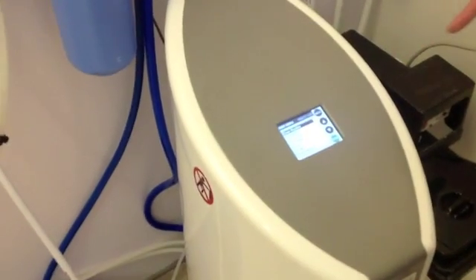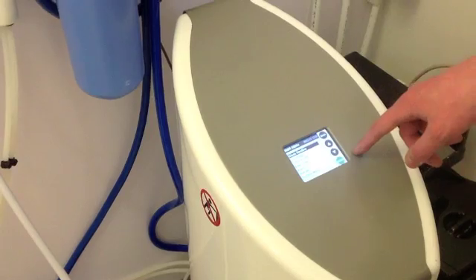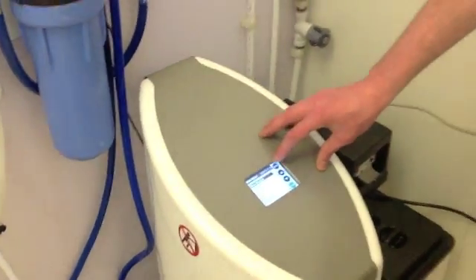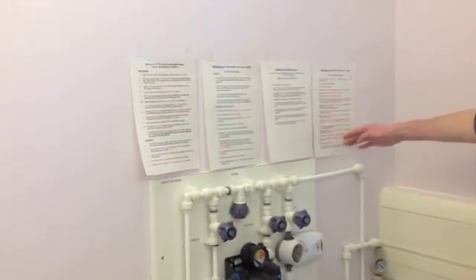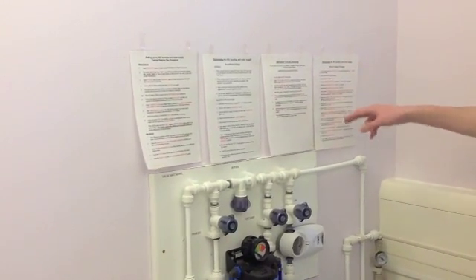Now the one that is highlighted will say 'clean routine' and you will then press enter on there. I am not going to do it for the purposes of this video because it will take me quite a while. But we will also give you a sheet of paper like this which will have every instruction step by step that you can read through.